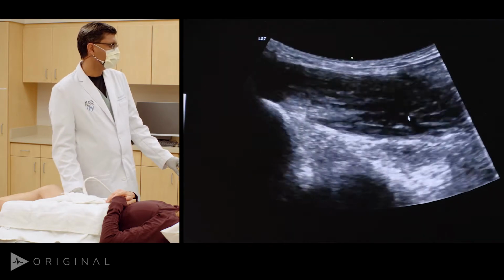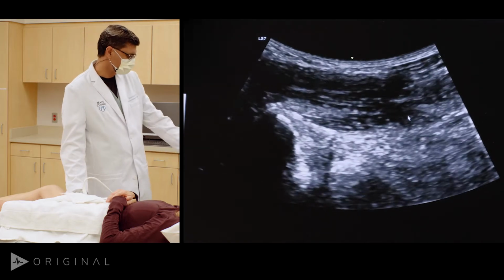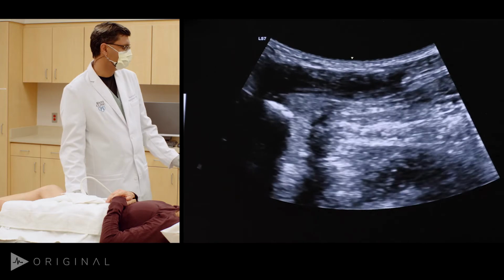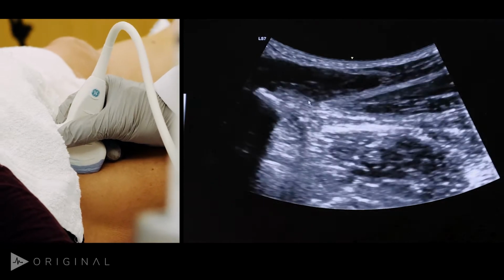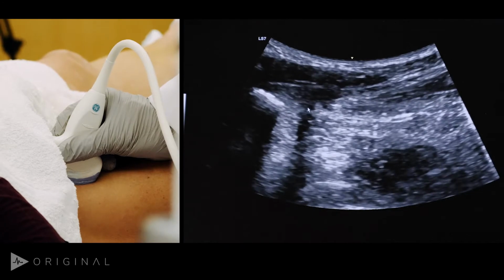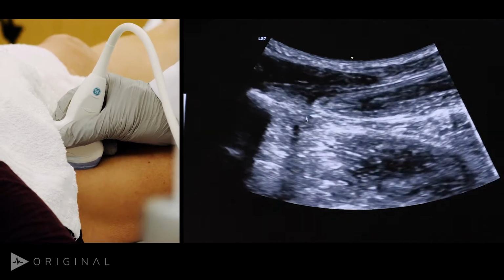Now the rectus femoris tendon starts from the anterior inferior iliac spine. So you can see here that's the anterior inferior iliac spine, and the tendon originates from there and goes down. You can see there's a lot of anisotropy just deep to the tendon. Why? Because it has two heads.